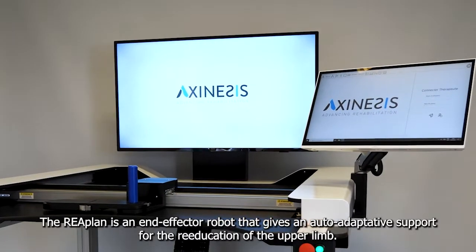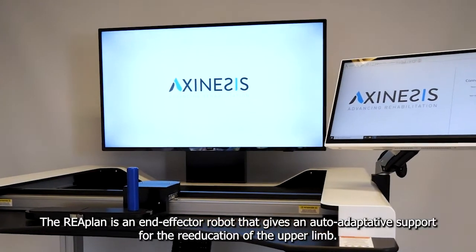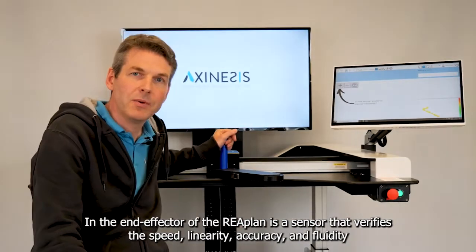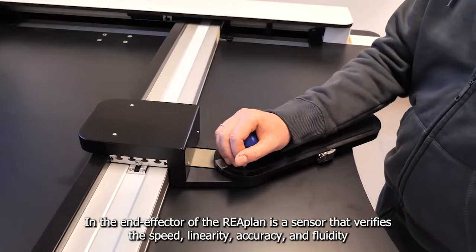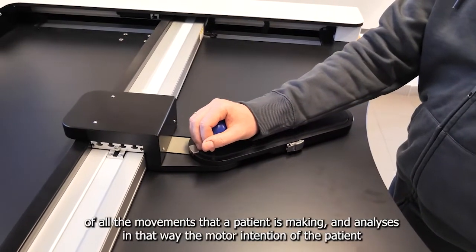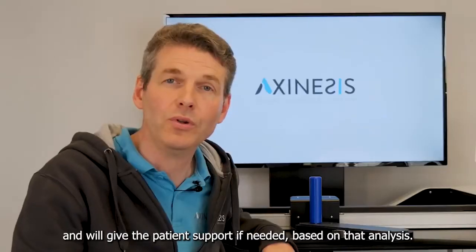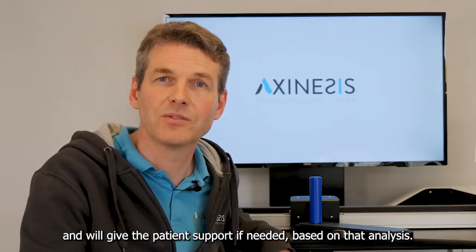The Reaplan is an end-effector robot that gives auto-adaptive support for the re-education of the upper limb. In the end-effector of the Reaplan is a sensor that verifies the speed, linearity, accuracy, and fluidity of all the movements that the patient is making, and analyzes the motor intention of the patient, giving the patient support if needed based on that analysis.